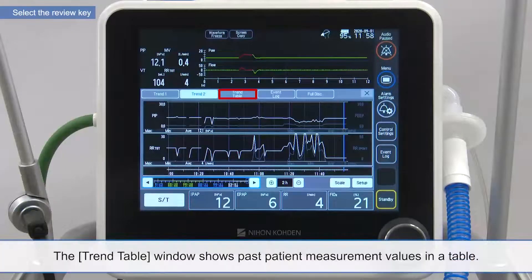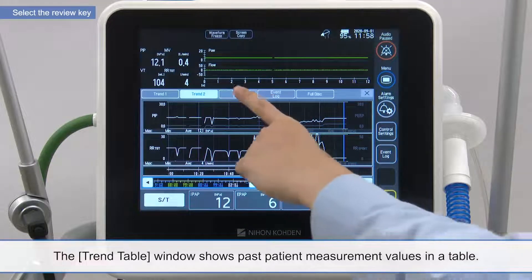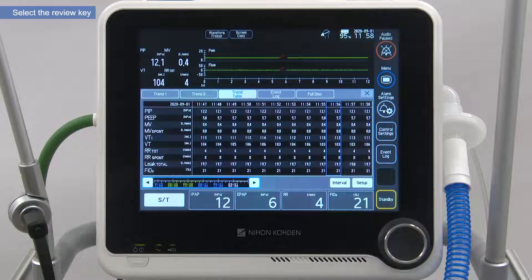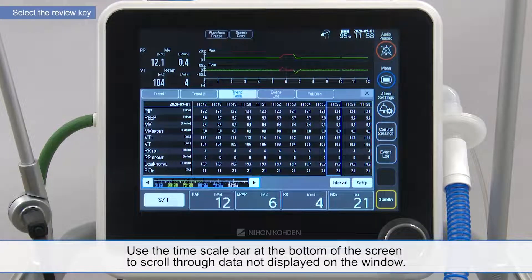The trend table window shows past patient measurement values in a table. Use the time scale bar at the bottom of the screen to scroll through data not displayed on the window.